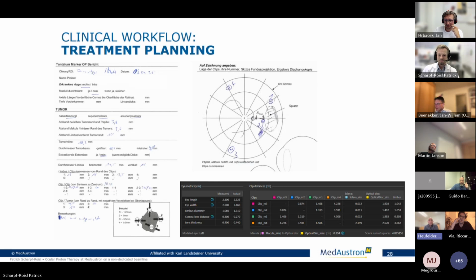Hi, nice presentation. Do you require additional X-rays at each patient break with irradiation when back to gaze direction, or do you trust manual drawn contours? So we usually trust the contours unless we see an offset in the head rotation, so meaning the help structures from the eyelids or the eyelid retractors, and an offset of the lens. Otherwise, we trust these manual drawn contours, because usually you see it quite well if it moves from there.